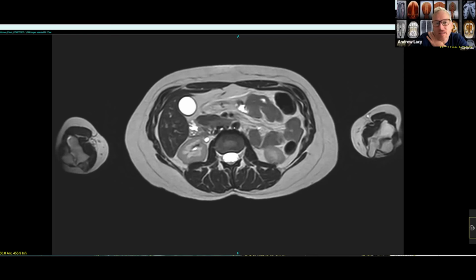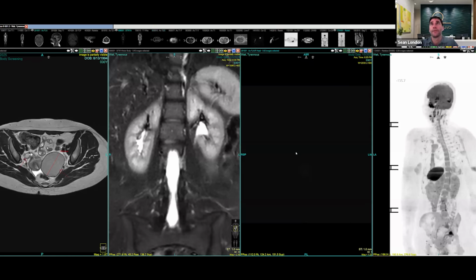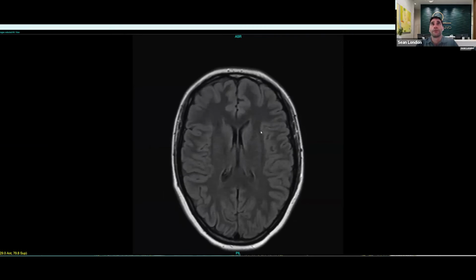What about stroke and TIA occurrences, detection of seizures? Yes, so we can see stroke. I hope we don't see any acute strokes in our clinic. Those should be going to the ER, but we can see signs of old strokes. The brain that I showed was very normal looking, and I didn't see any signs of old stroke or something that we call white spots, which are commonly attributed to small vessel ischemic changes. So what they'll show up as is bright white spots within the brain tissue. So we could see signs of old stroke or little micro strokes.